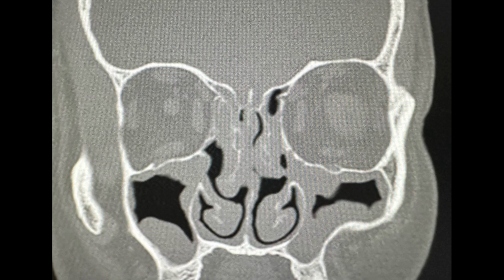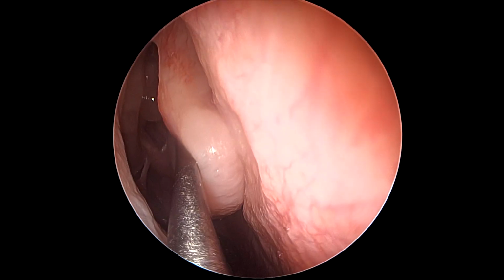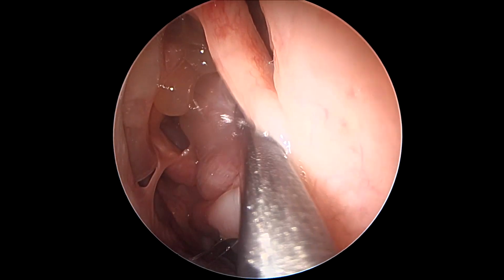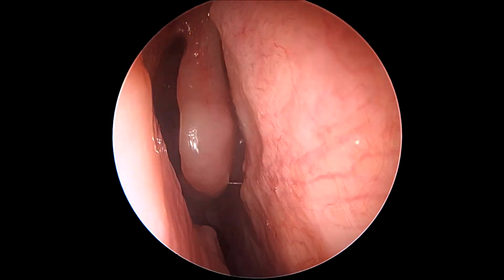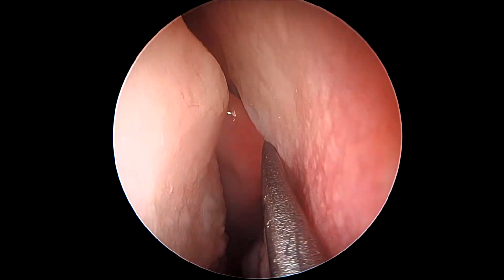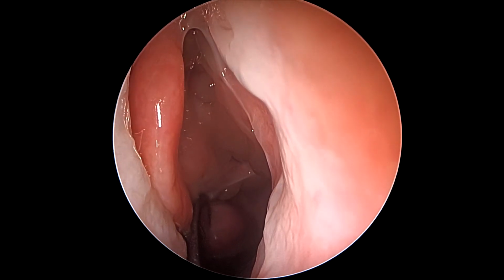One can see patchy opacification in the anterior ethmoids, occlusion of the osteomeatal recesses, as well as, you can see here, the presence of a type 2 or type 3 cone cell anteriorly, and over which one can see pneumatization of a frontobullar cell, which pneumatizes right inside the frontal sinus, which can often be confused as an isolated frontal sinus cell, which mostly is a frontal bullar cell. And that is because the posterior wall of the frontal bullar cell happens to be the skull base itself, unlike the cone cells where there is a distinct posterior wall of frontal sinus behind the cone cells.